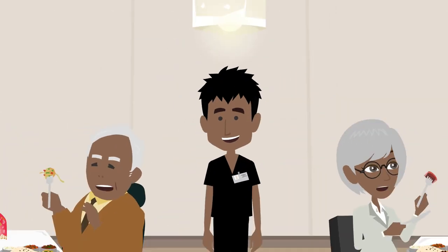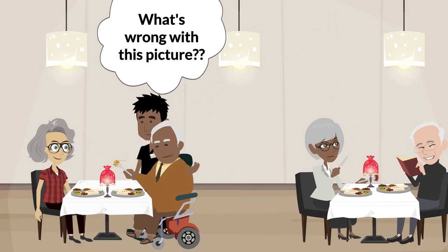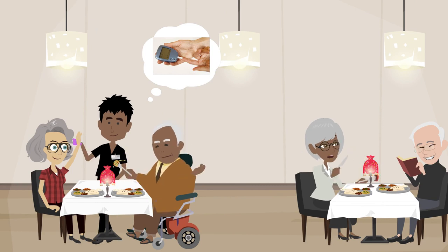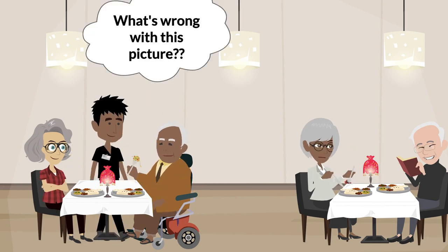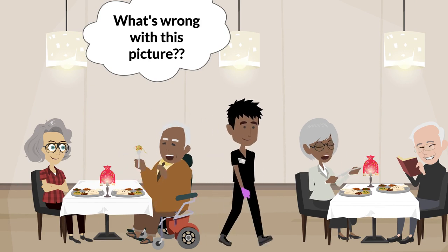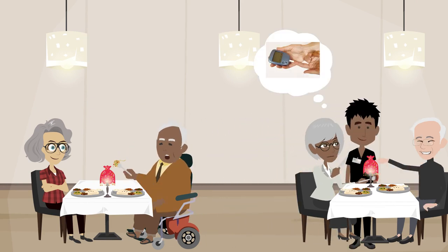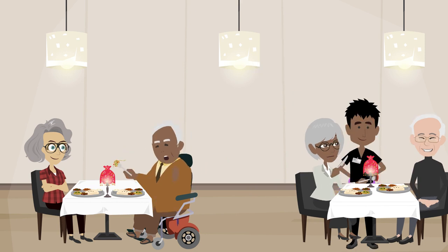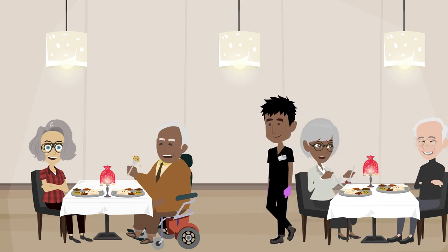This is Eric. He is using the facility glucose meter for multiple patients to measure their blood glucose before dinner in the dining area. If he sees blood on the meter, he plans to wipe it off with an alcohol pad between patients. What's wrong with this picture?